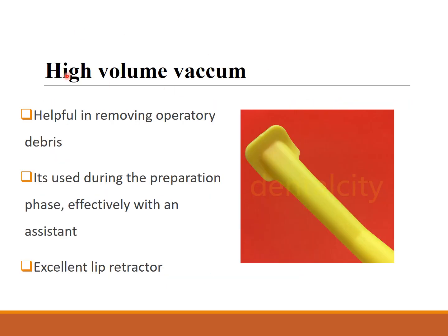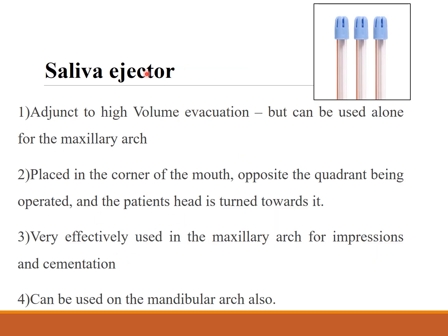High volume vacuum. These are suction tips which can be helpful for removing operatory debris. It's useful in the preparation phase, effectively with an assistant, and also an excellent lip retractor. Sorry, that was the high volume vacuum.